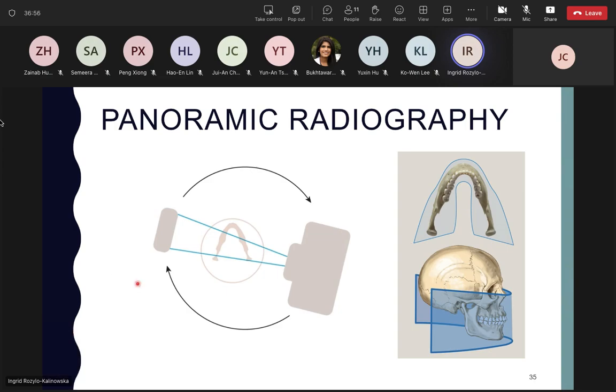As far as the technology is concerned, in contemporary panoramic machines, tomographic movement principle is applied, and this is rotational tomography. And in fact, the idea for rotational tomography first appeared in Poland because it was a medical radiologist, Ernest Matuszko, before the World War II, who constructed a device for taking rotational tomograms, but unfortunately he did not publish his results before World War II.